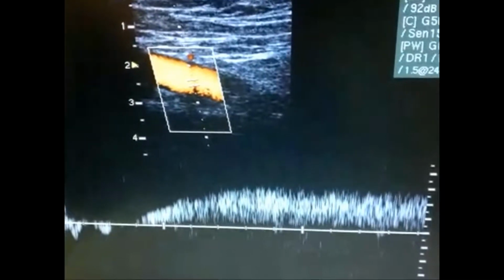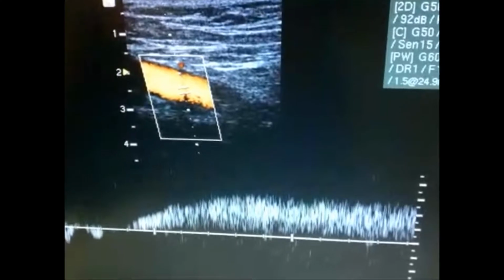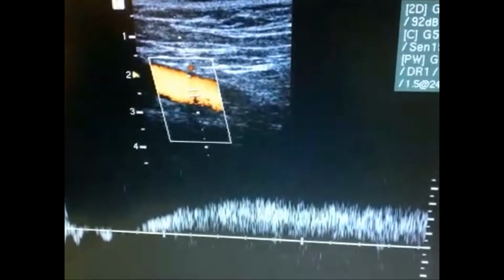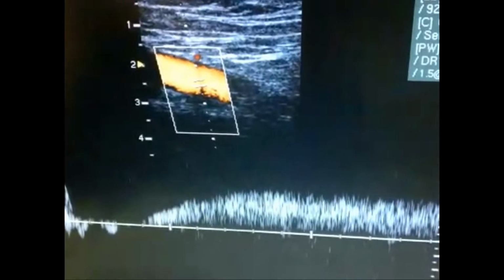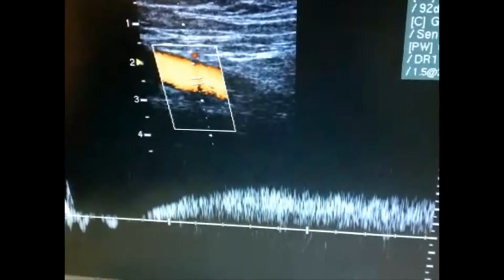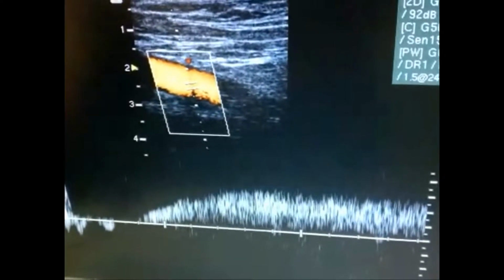We want to demonstrate a very high continuous flow rate in the deep venous return in the right sapheno-femoral junction. As you see, there was a Valsalva maneuver done and it stopped the flow, so that proves it's venous, but then it returned straight back to its incredibly high venous return. We're now going to go to live mode.